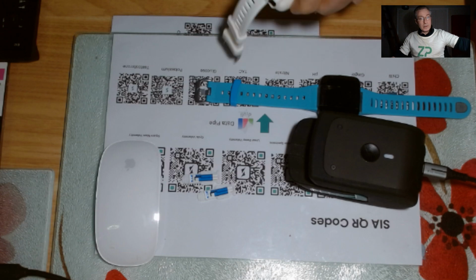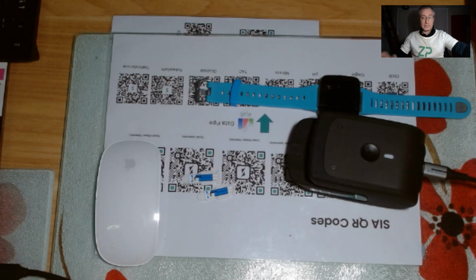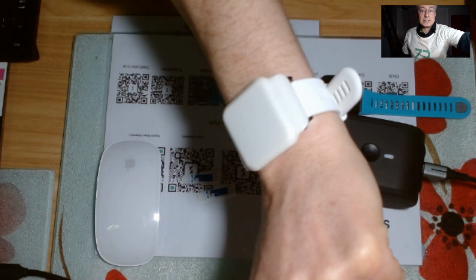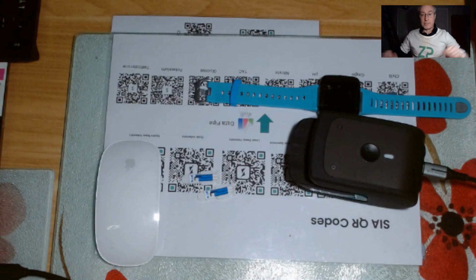And then another example of where you can use enzyme sensors. This is a microneedle type watch that can be worn around the wrist. What happens there is you've got microneedles that are functionalized with enzymes, for example, and then you can detect something like glucose through the skin using microneedles.